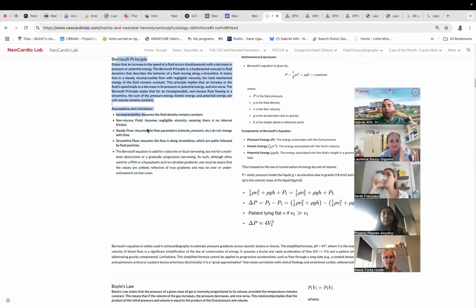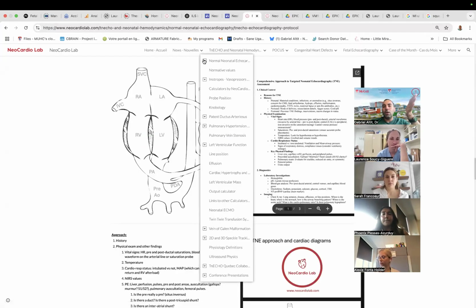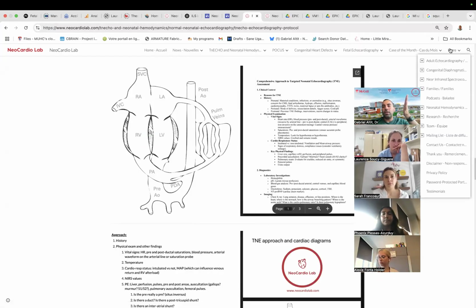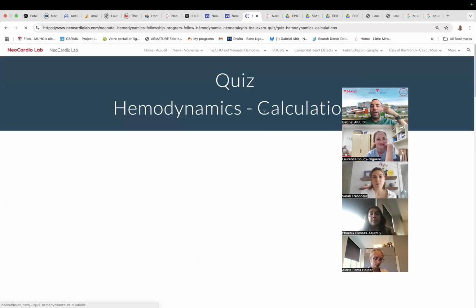I think you should know what the assumptions of Bernoulli are and why we should not use it for certain things. The fact that I made you use Bernoulli for the PDA is something many purists would tell you is very, very wrong.